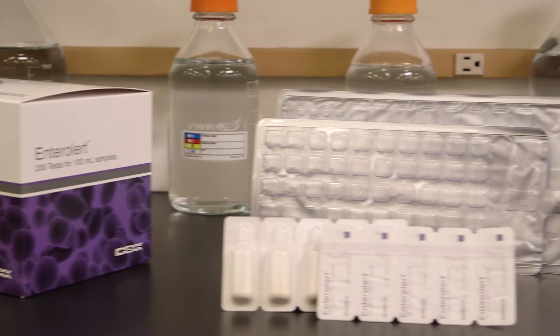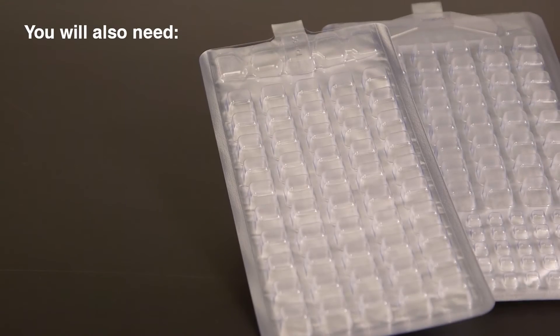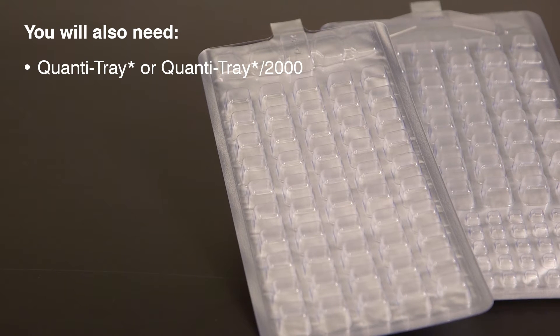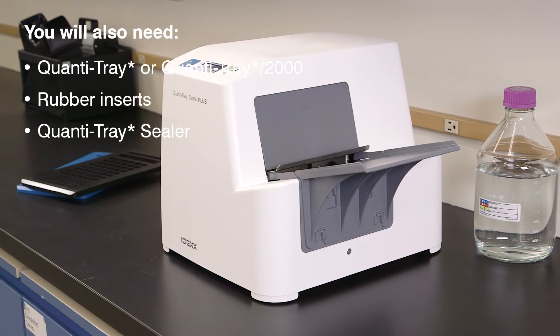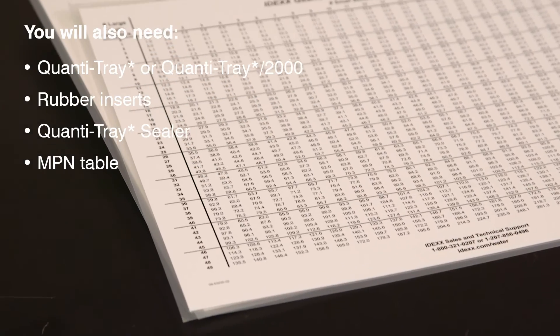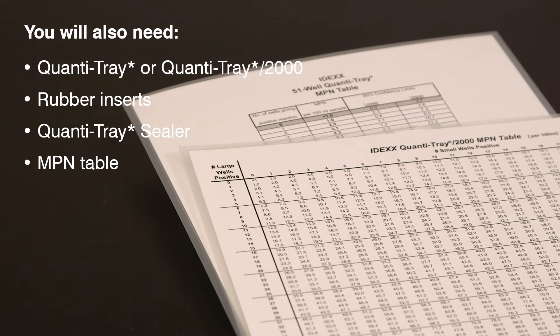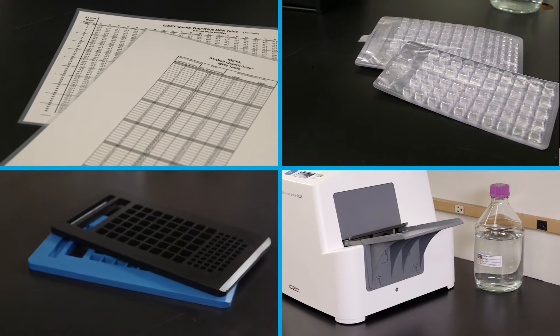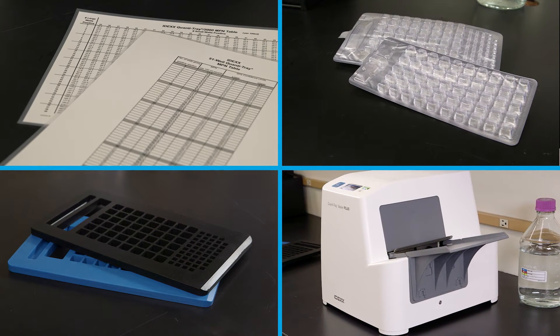In addition to the materials used for presence-absence detection, for quantification you will need a Quantitray or Quantitray 2000, Quantitray rubber inserts, a Quantitray sealer, and the included most probable number table or the IDEXX automated MPN generator program found at IDEXX.com. All of these items are included in the Quantitray system and are available from IDEXX.